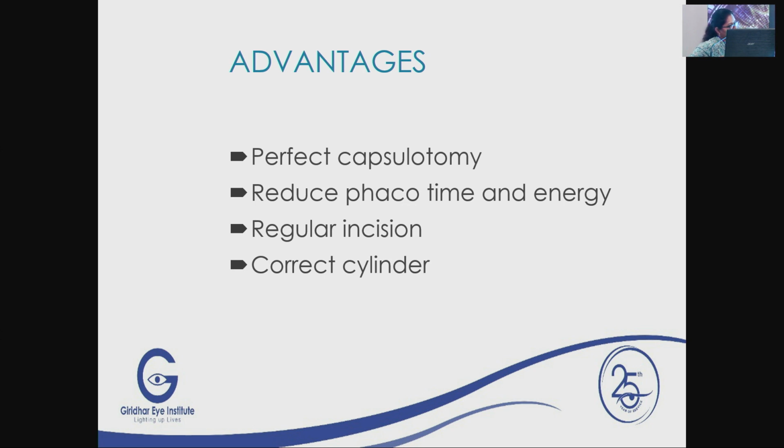The advantage is perfect capsulotomy. It reduces the phaco time and energy, regular incision, and it corrects cylinders to about 1.2 diopters.